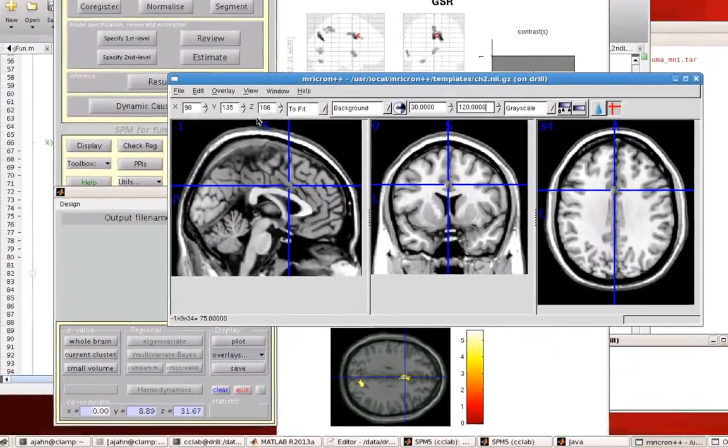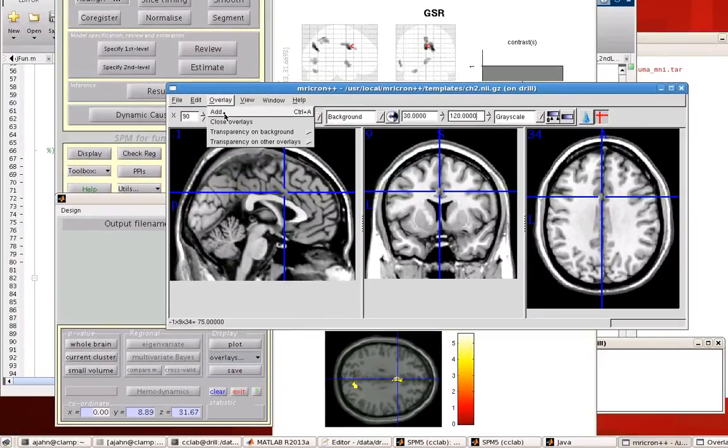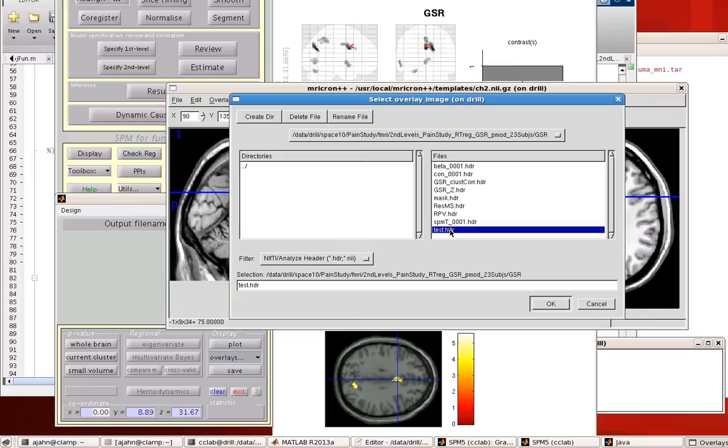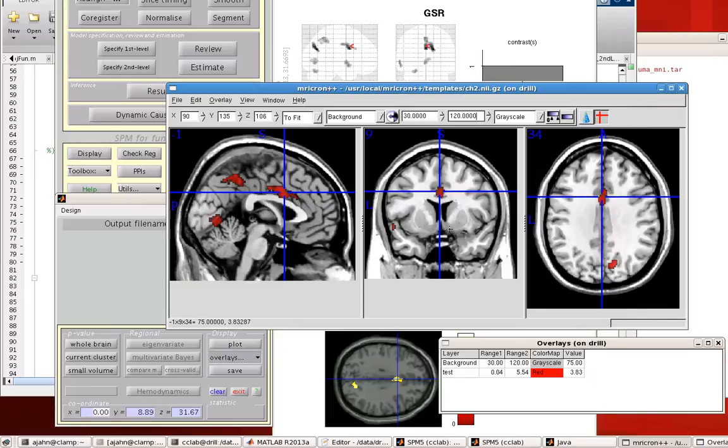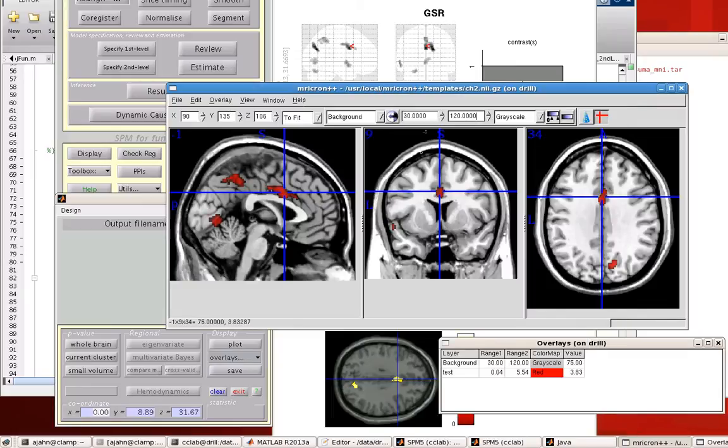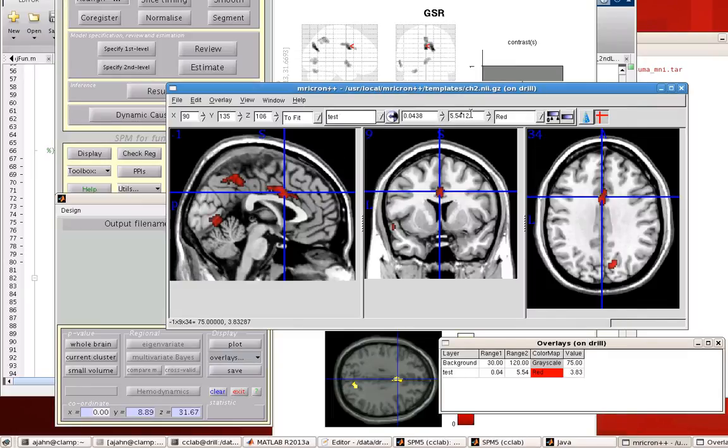You can then use something like MRI-Cron. Go to overlay, add, and then load that. So now what you see here, and we can modulate how bright it is right here. But now it's been imported, and you could use this to make another figure in MRI-Cron.